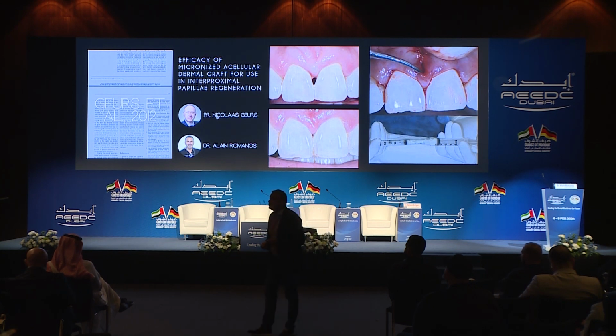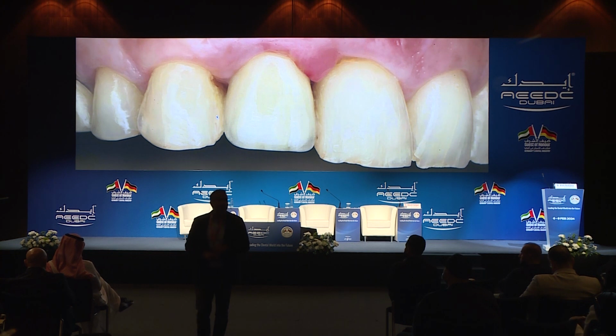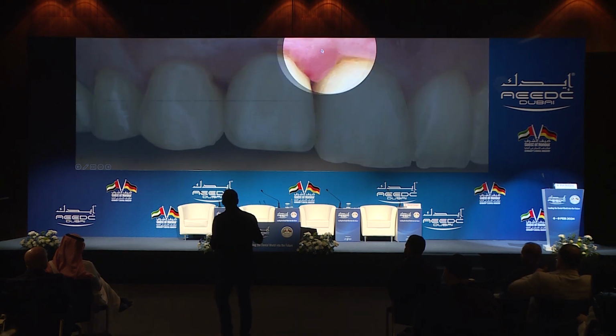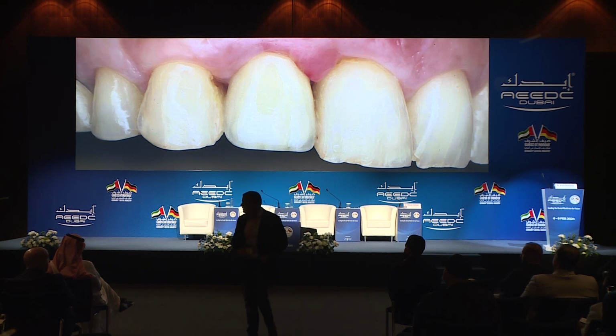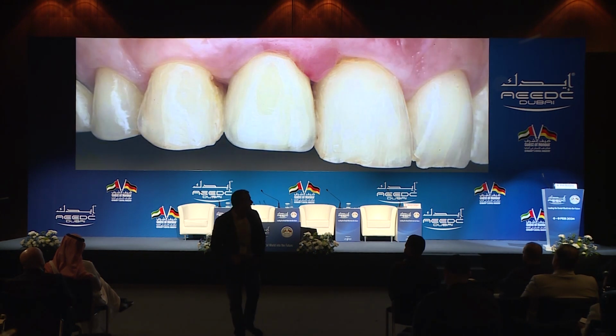In these cases, sometimes the filler works. So we did fill this over multiple appointments, 3-4 sessions, and we were able to drop the papilla just a little bit. Not completed yet, but it's an acceptable result. And you have to expect, when you have a complication, you cannot aim for 100%. You always have to aim for 70, 80% improvement. And this is where we got today with this papilla.